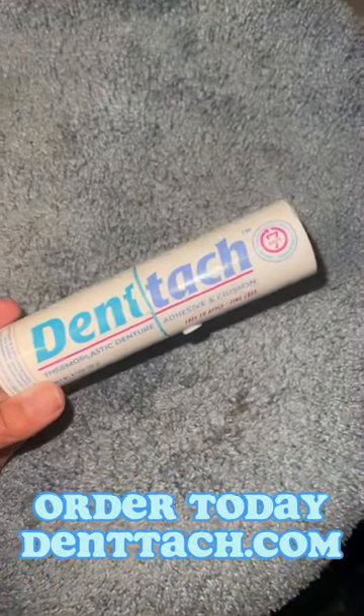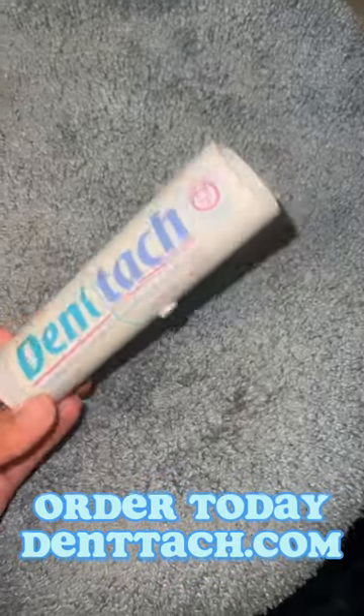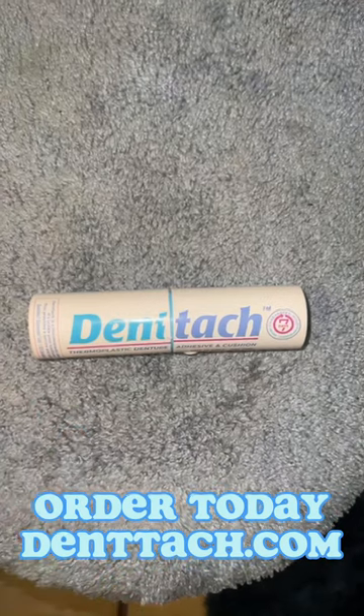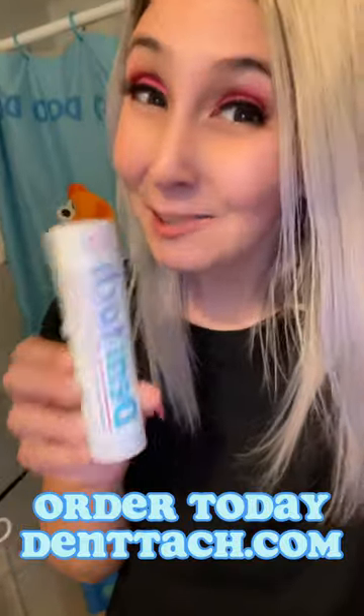I'm able to eat what I want just like my natural teeth, so I'm not complaining. If you are interested in trying this wonderful stuff, it is available on the Dentac site. It also comes in really cool packaging, which I think is neat. And it lasts for seven days — that's another great thing. Denture wearers, go get you some, it's awesome!